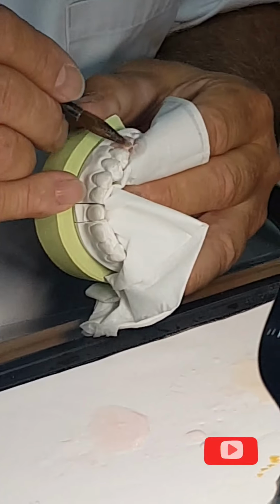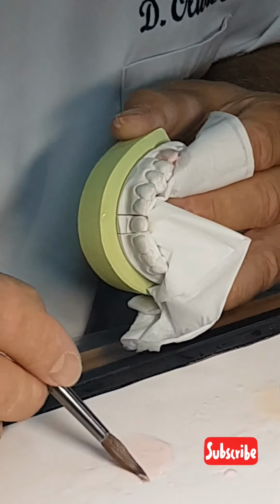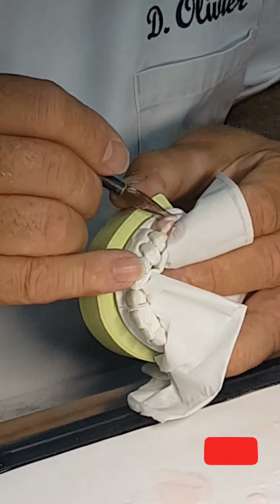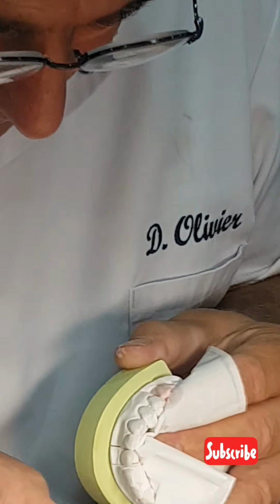Do you like to use only water for mixing powder? Water. French water. Sometimes French wine, but it's at the end of the day.